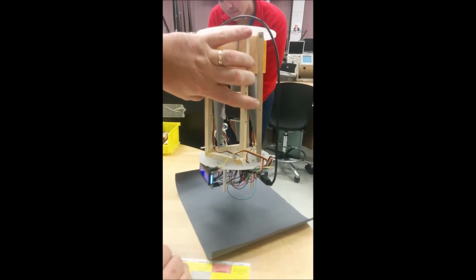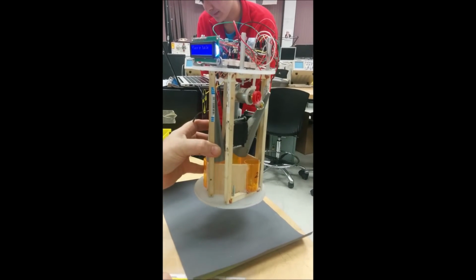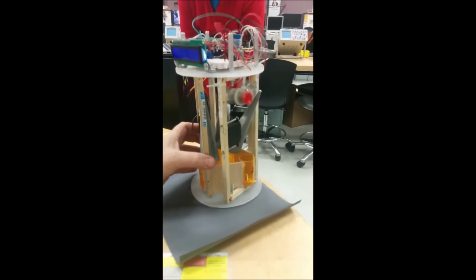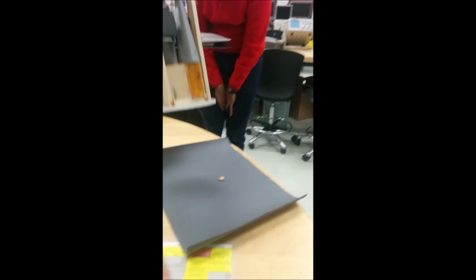The cone rotates, and the motor vibrates against the cone and knocks the medication out of the device through the bottle. The electronic display then confirms that the medication has been dispensed. The cone returns to its original position, and the device remains dormant until the next time a signal is sent to dispense another pill.